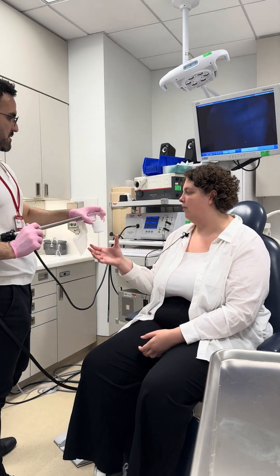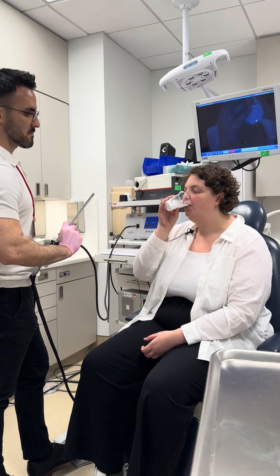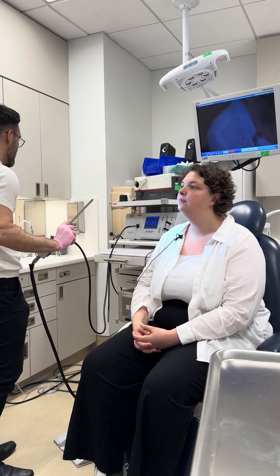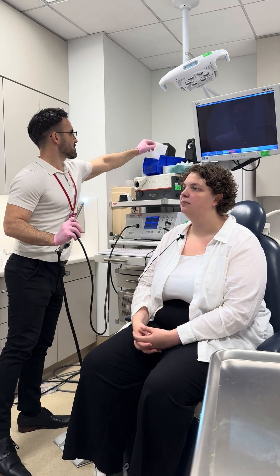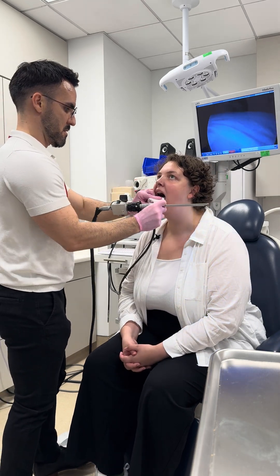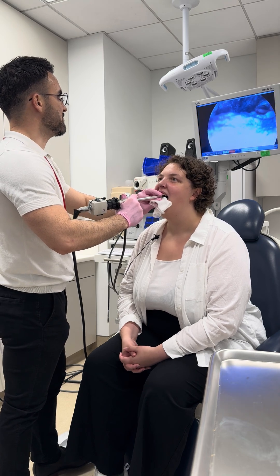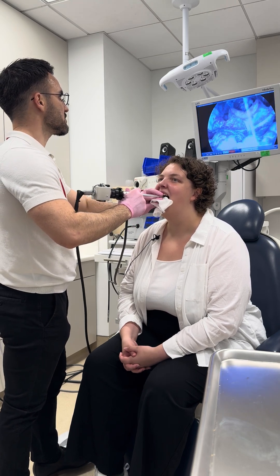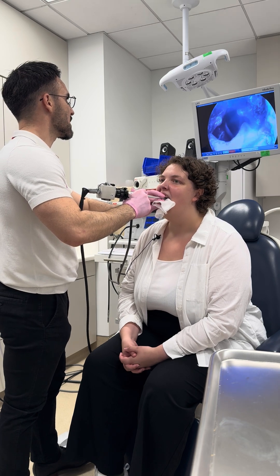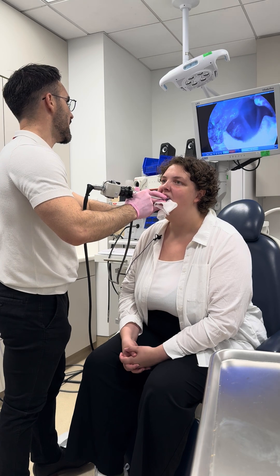And now go ahead and drink a couple of sips in a row. All right. I'm just gonna grab another one of these. Chin up, tongue out. Good. Gently bite down, smile and say eeeee. Good, breathe. Again. Good. And breathe. Excellent.